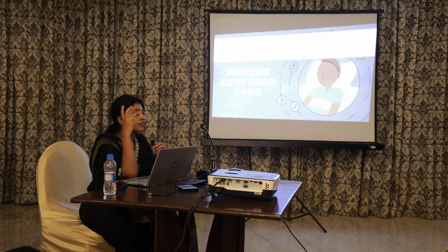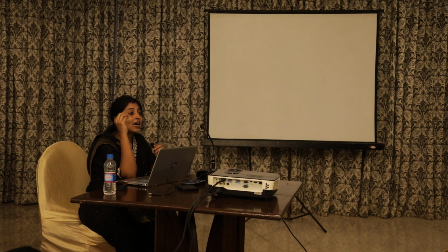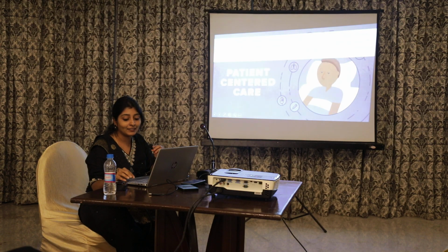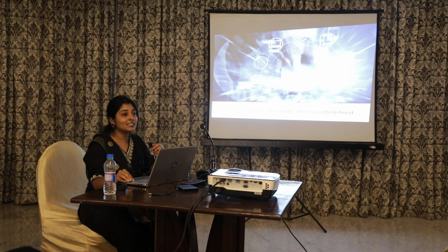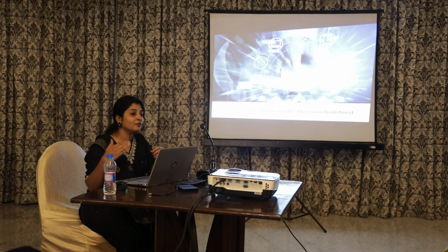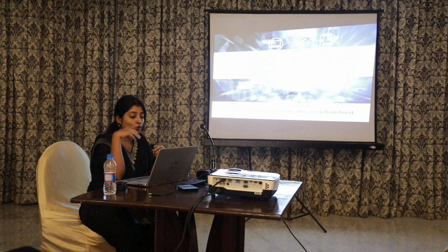One of the key advantages of clear aligners is the comfort that they provide to the patient, because they can indulge in whatever food they want to eat, so there are no absolute food restrictions. Additionally, they can maintain oral hygiene as well, which contributes to better overall dental health. And obviously it is a technological advancement, so the precision is redefined every year, and every time they are updating the protocol.